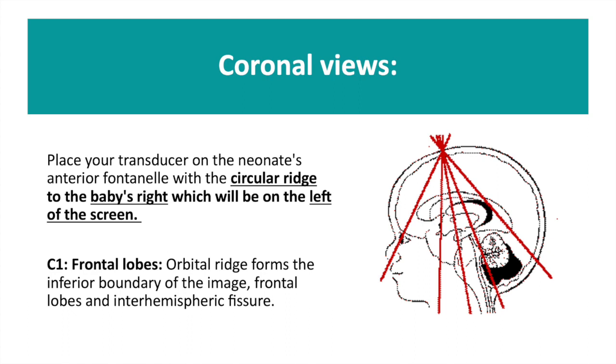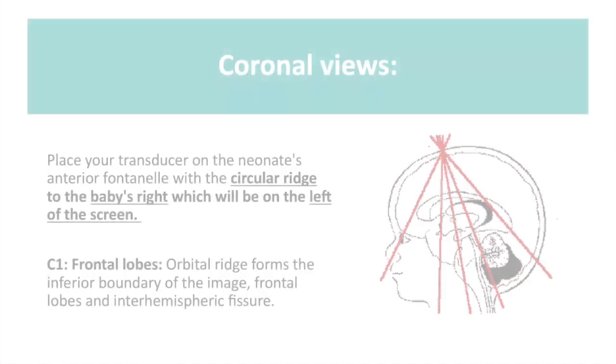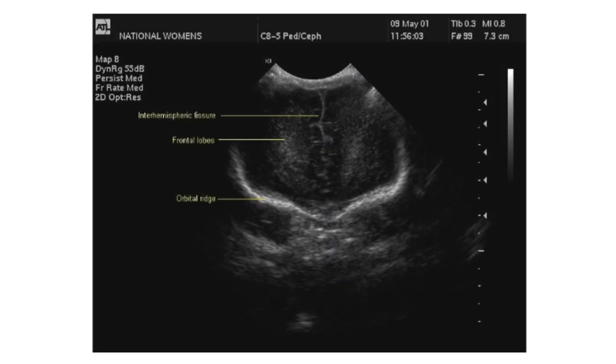Start by taking images of your coronal views. C1, you can see here, is the most anterior view that you will obtain. It takes a slice of an image through the frontal lobes in which you can see your inter-hemispheric fissure and your orbital ridge.